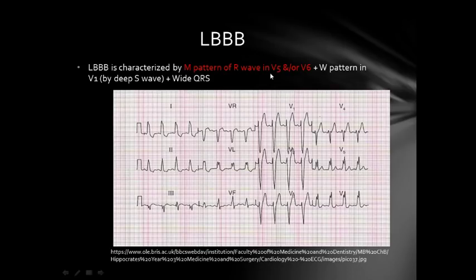Left bundle branch block also has an RSR' pattern, but the two R waves are closer together, so it's called the M pattern — seen in V5 or V6. You can see V5 and V6 both have this M pattern. So this is left bundle branch block.